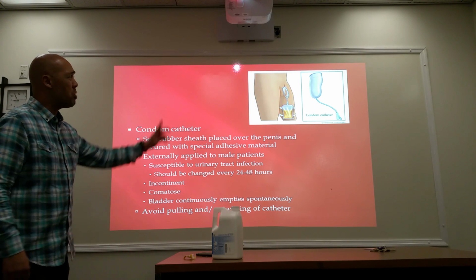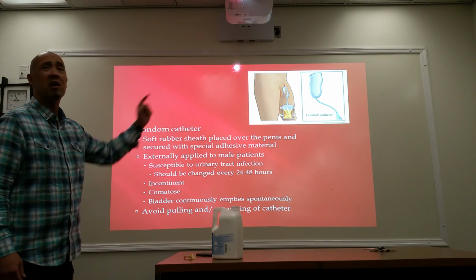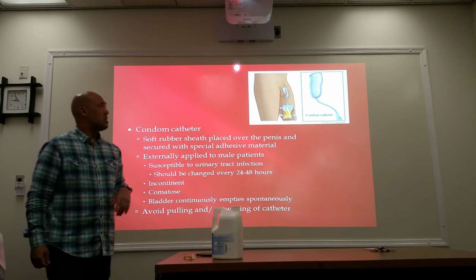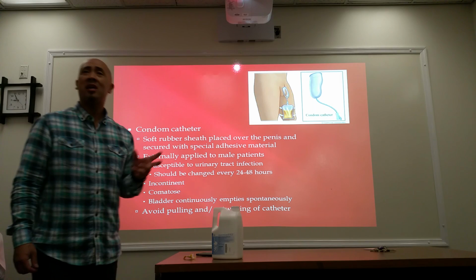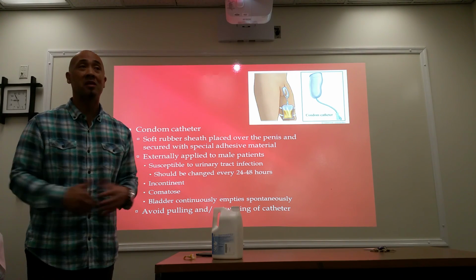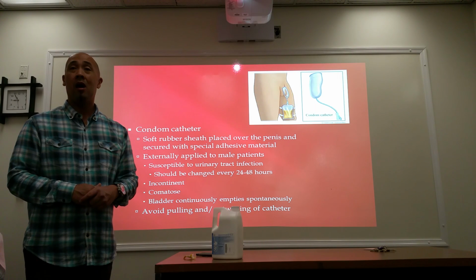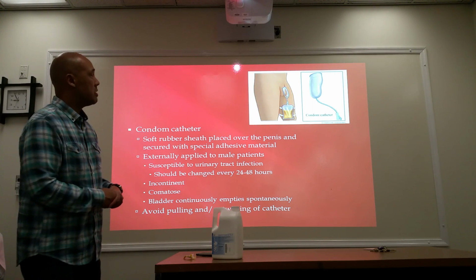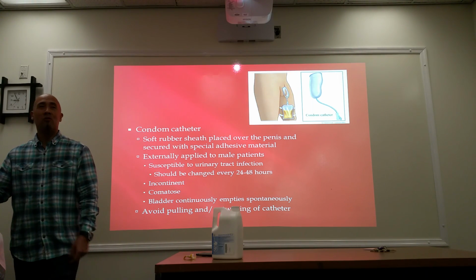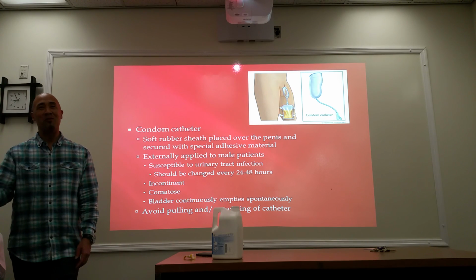Yeah. We do this a lot in the cardiac cath lab. We place this in the cardiac cath lab only because we medicate our patient and sometimes they become incontinent and they just kind of pee spontaneously. Just pee or both ways? Pee. Oh, okay. So we put those on. And then for females, we're mean to the female patients, so we get a urinary catheter.